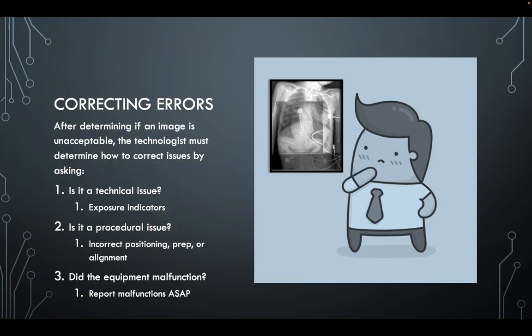So have them hold still, and if you see your x-ray, you recognize that it's a rotation issue, and maybe you see your adductor tubercle, and so you know that you need to externally rotate a little bit, then you're able to easily go into the room and shift your patient just a little from the position that they were in during the exposure. So just keep that in your mind as you're moving forward with some of these things.